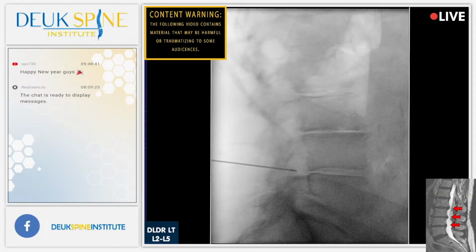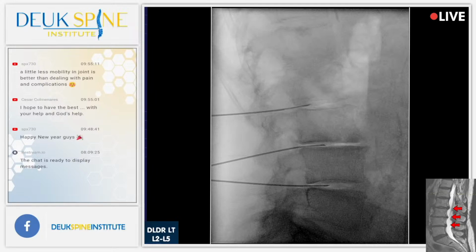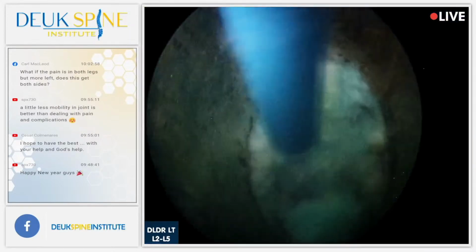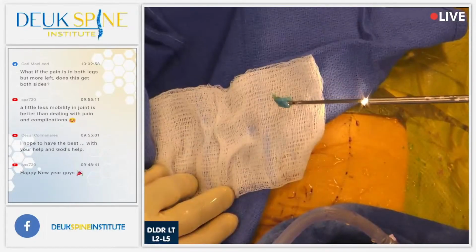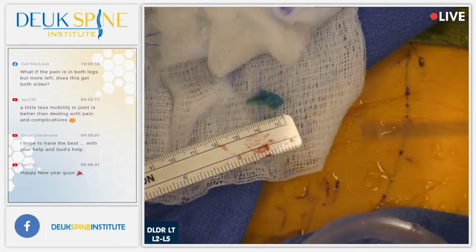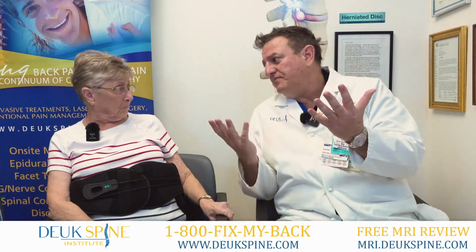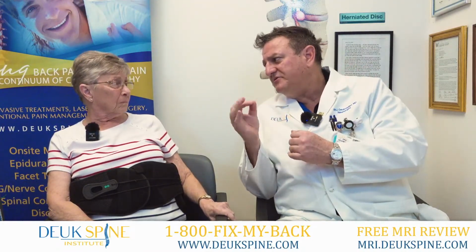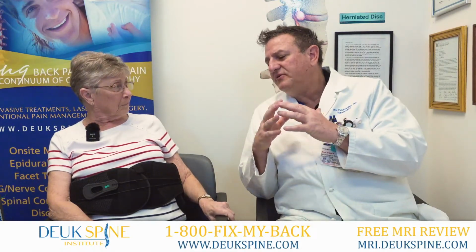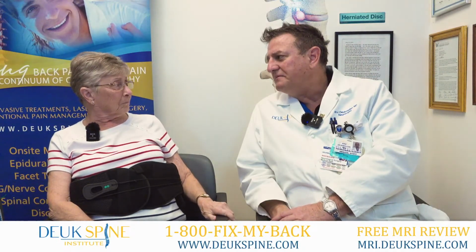Well, you had 3 herniated discs in your lower back, and you can see in the footage where we went into each of those 3 discs, and I used a laser to clean the tear, where you had a tear in the back of each of those discs called an annular tear. The jelly from the center was stuck in the tear, holding it open, allowing more herniations to come out. So I got rid of the jelly that was in there using the laser, cleaned out the tear, and now your body will be able to heal that for the first time in 30 years. So I don't expect you to ever have that pain ever again.